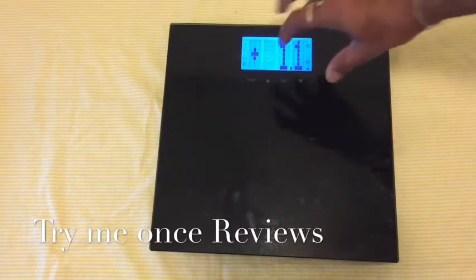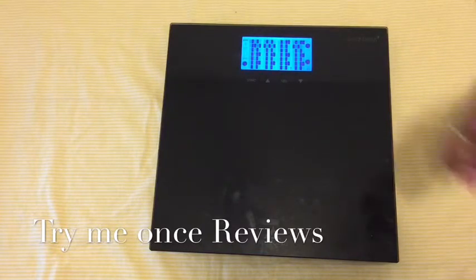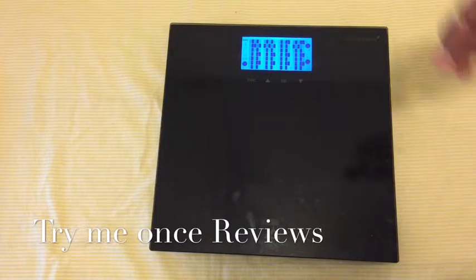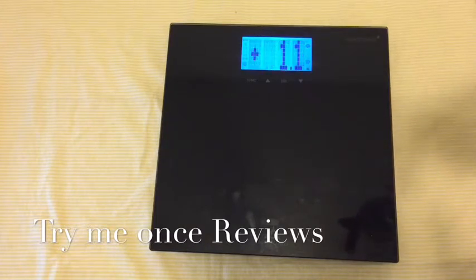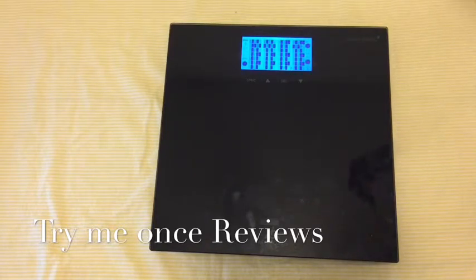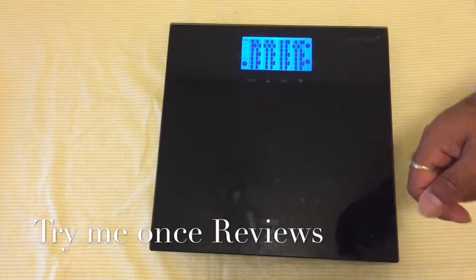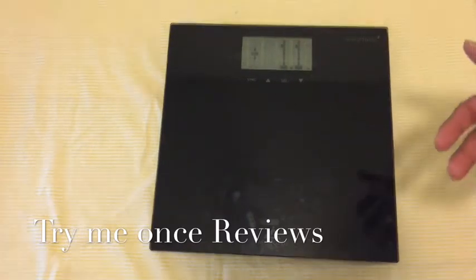From time to time, the screen changes and you see a code generated — this is a syncing code. Weight Gurus has a mobile app for iOS and Android; you install the app and then scan this code. As soon as you scan it, the app reads the value and keeps track of it. Some Weight Gurus scales have Bluetooth, but this is a simplified version — they generate this code and the mobile app reads it from the code and keeps the track.